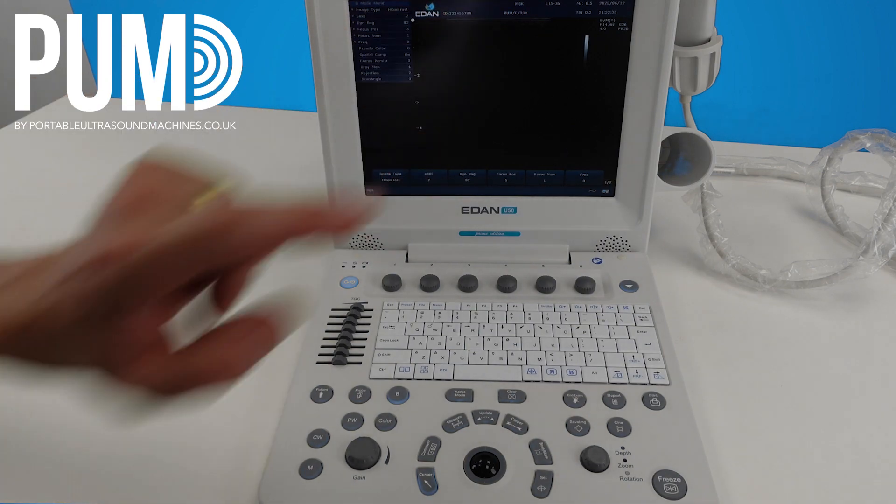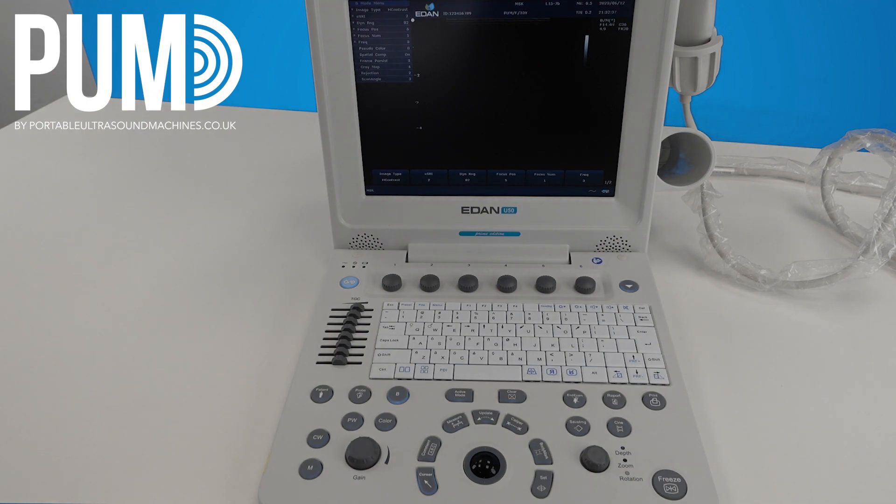Your preset does appear on the top of the screen. So now we can get scanning and we're in our 2D image. We have our overall gain here, so we can adjust this by twisting clockwise to increase the gain and anti-clockwise to decrease the gain. We have our mode selections here — at the moment we're in B mode, so just a normal 2D image, and that's highlighted.